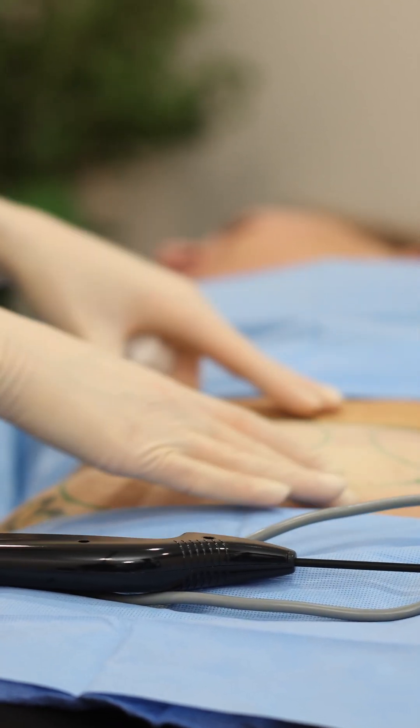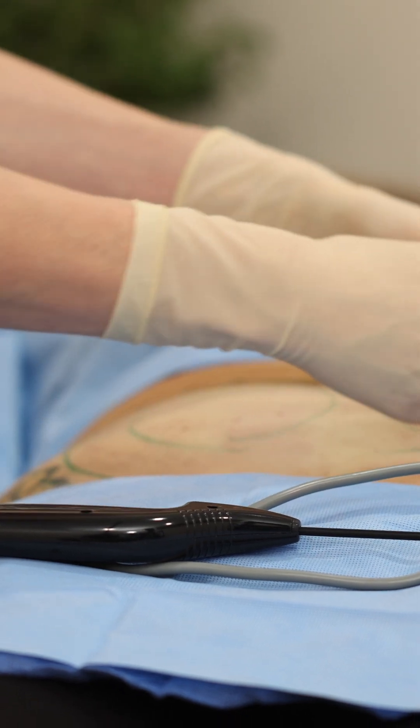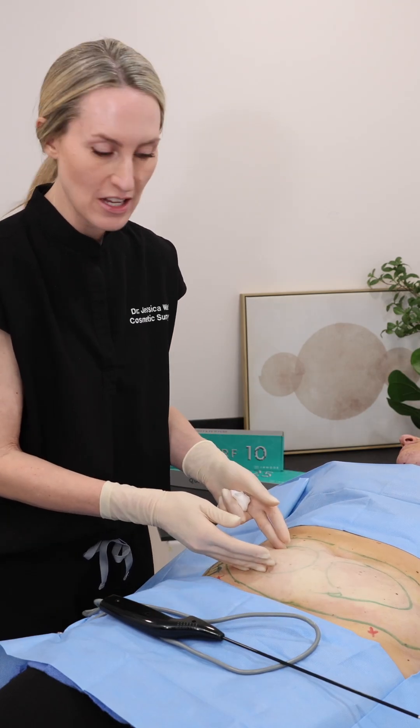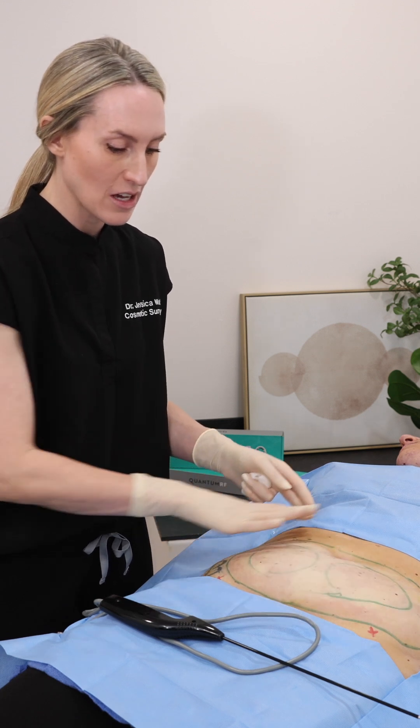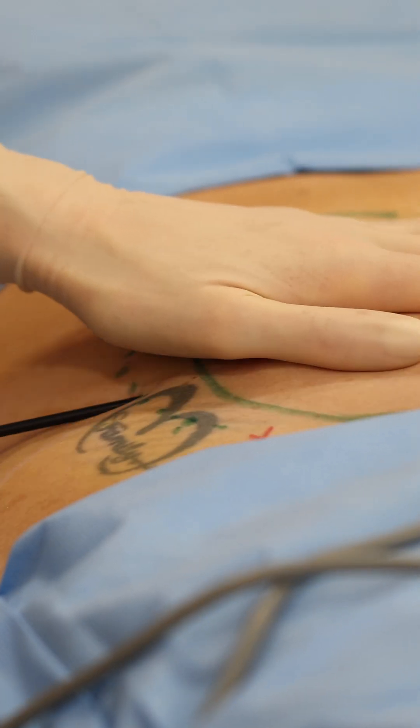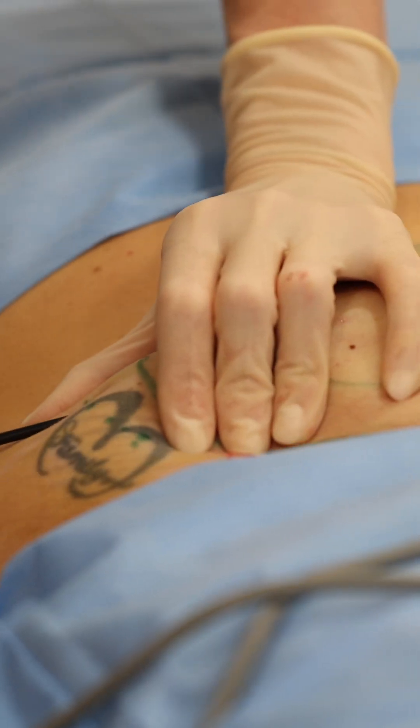When we're treating, we've calculated the number of pulses to appropriately treat this area. Sixty percent of the treatment and energy applied will be in the apex here, while we're blending the additional forty percent to the periphery. A little pressure here — let me know if anything is uncomfortable.